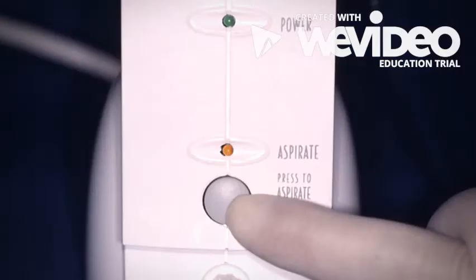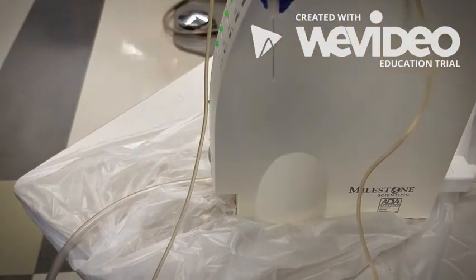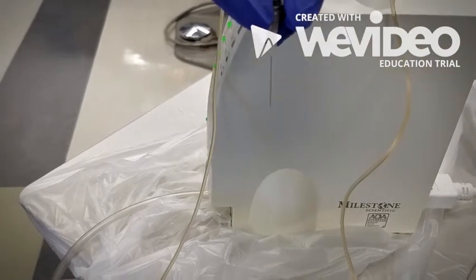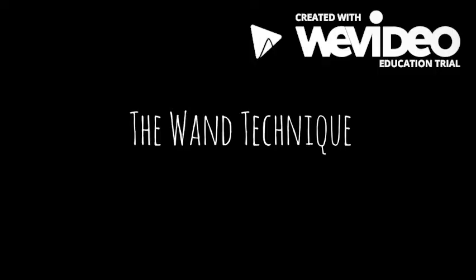After the purge, the unit automatically goes into aspiration mode and the light will be on. Then we will need to perform the aspiration pretest. With the needle bevel down, press the foot control to slow speed for 4 beeps and release. When we see the drop recede, we know aspiration is working. When removing the cartridge, press and hold the aspirate button to withdraw the plunger. Push the cartridge holder down firmly and twist to remove.